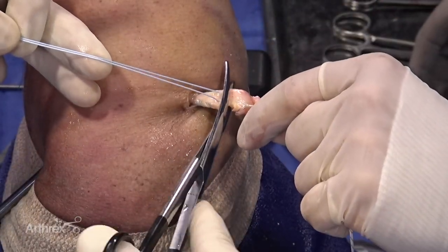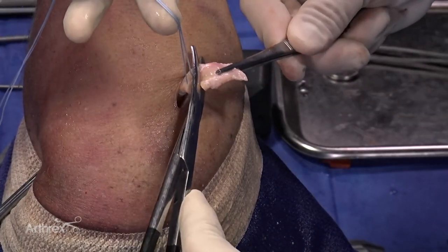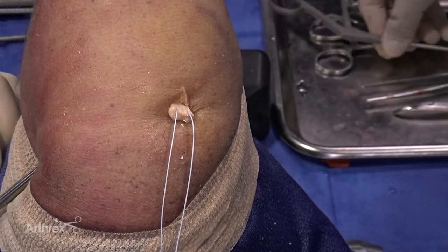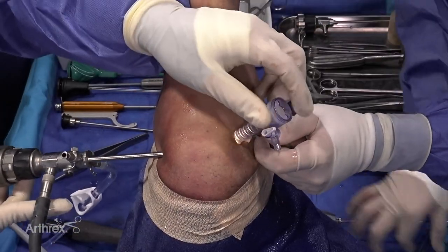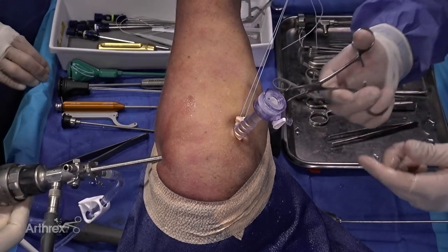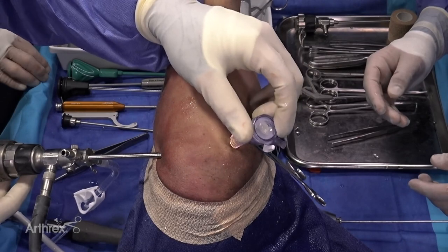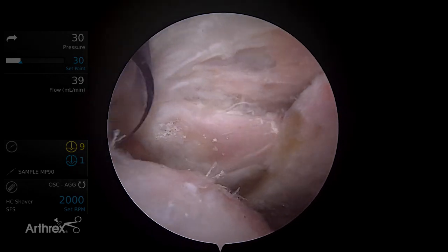We're going to resect the proximal 20 to 25 millimeters, and that will help us maintain our length-tension relationship. I've moved to the onlay technique because it gives me a versatile tenodesis that I can incorporate into a swivel lock for rotator cuff repair. To protect the biceps tendon during this step, pull up on the sutures on the outside, place a snap just adjacent to the skin to prevent the tendon from pulling back into the joint, with the cannula protecting it on the medial aspect. There you can see our tendon just behind the cannula — safe and out of the way.